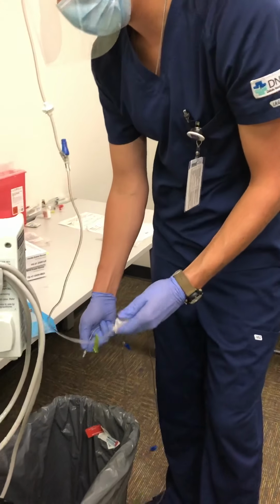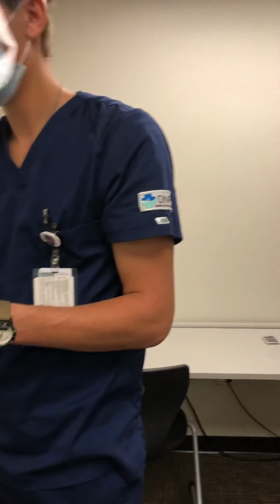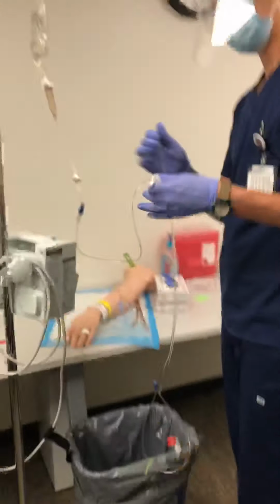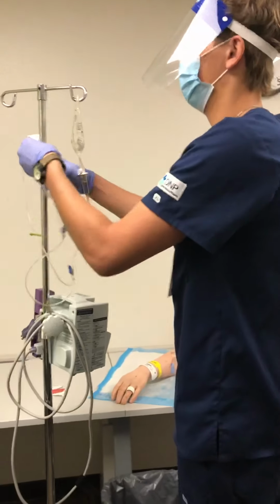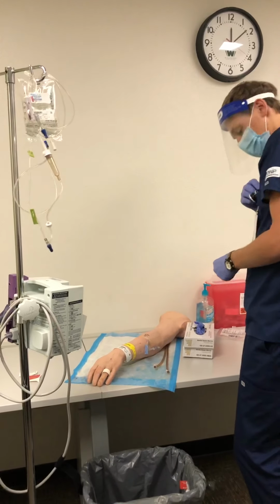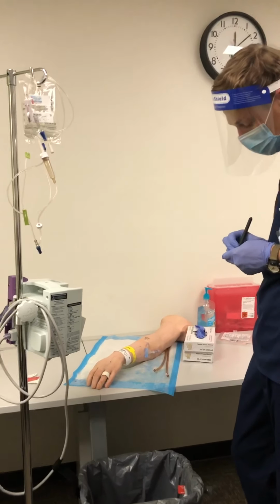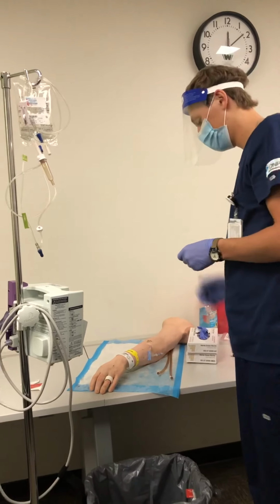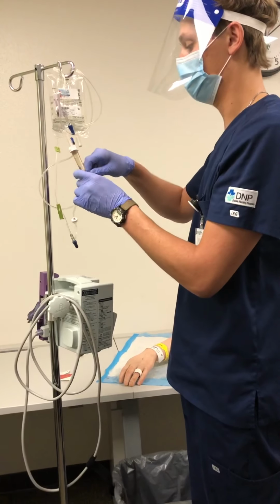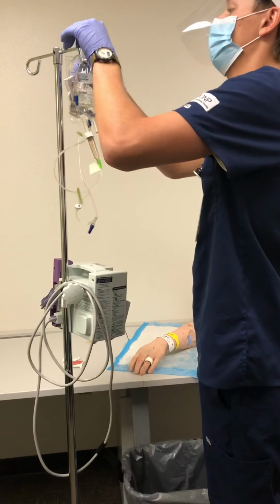Now once I'm flowing, I can go ahead and stop this. Put my locks on, put my cover on, and lock on. And hang this so that it stays sterile. And then I can throw in the IV tubing label what time I put it up, what day, and then initial it too. Okay, so that's all done. I'll put that right underneath the drip chamber here. Okay. So now we're ready to install this into the patient.